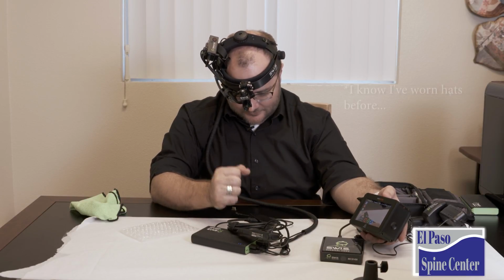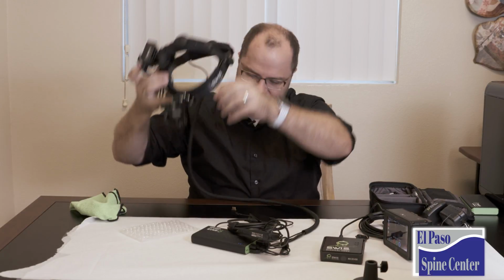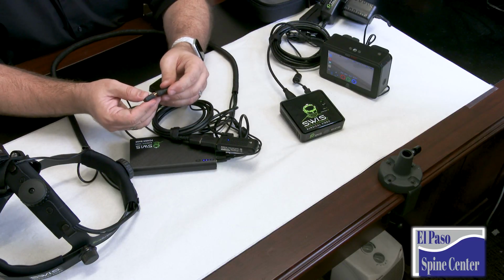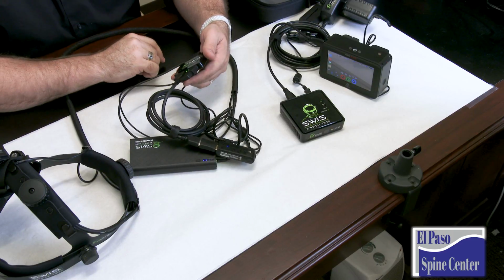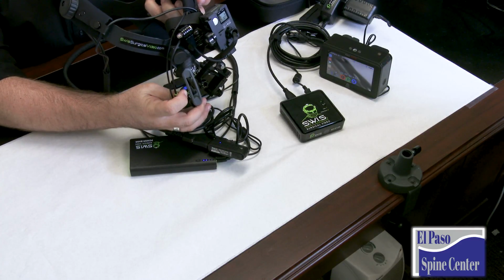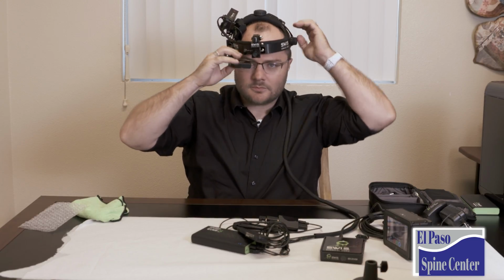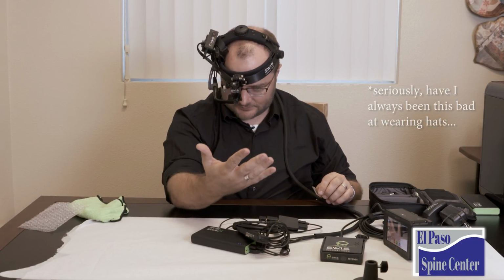Hi. Now, I'm still not seeing anything in here. That's because I have that other mini HDMI. I'm going to go back and grab my mini HDMI right here, plug that in, plug that into my HDMI splitter. Then I'm going to turn on my viewfinder by pressing the power button in the back. It'll blink for a few seconds while it's looking for the HDMI signal. And now it's blue. And I put this on, and I can now see everything that my camera is seeing.